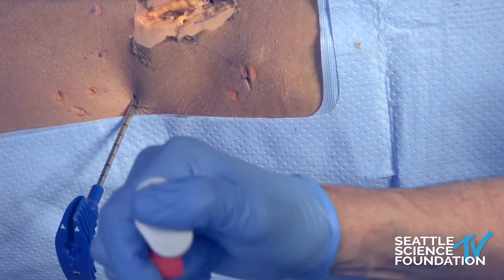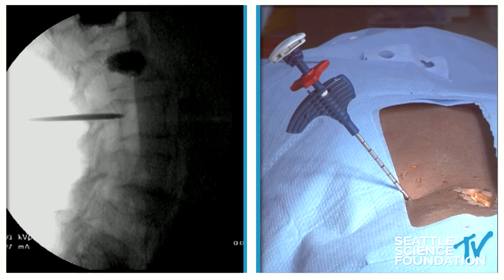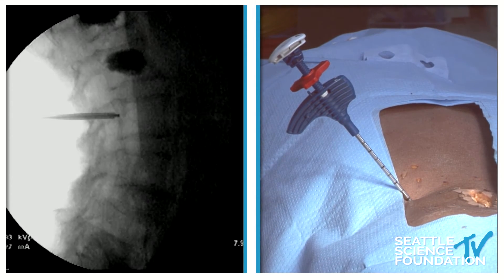For insertion, it takes a little bit of practice to be able to do this, but we insert it like that and we will see the stylet come out.